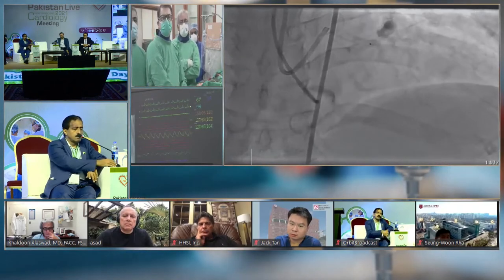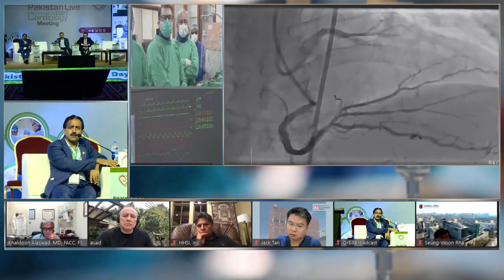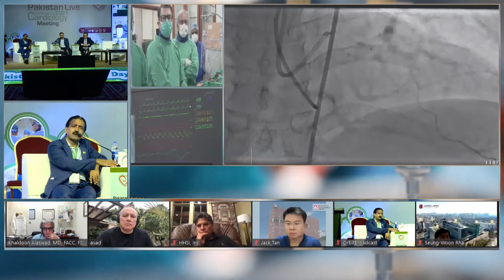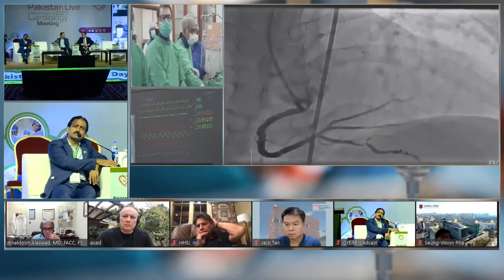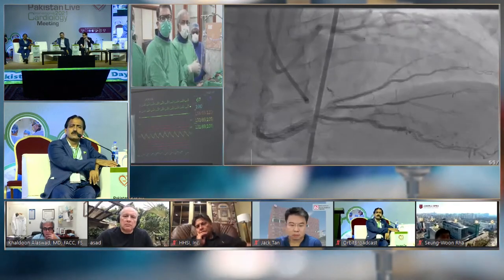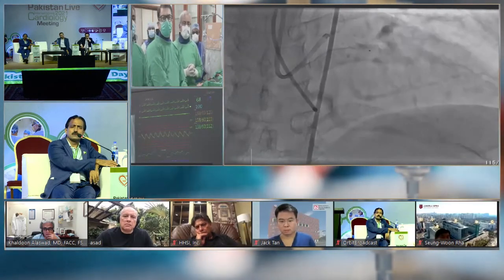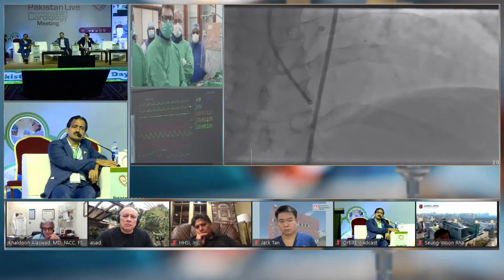So we thought that we're going to start with a Pilot 200. I think anything less would probably have been difficult, with so much calcium there. It wasn't a question of just finding a way around. I need a little push. So then we started fiddling around with a Pilot 200. Next, please.